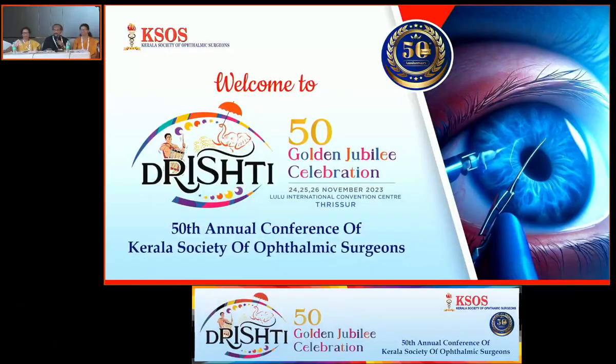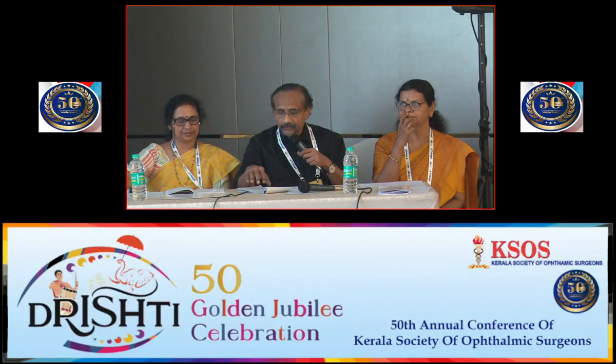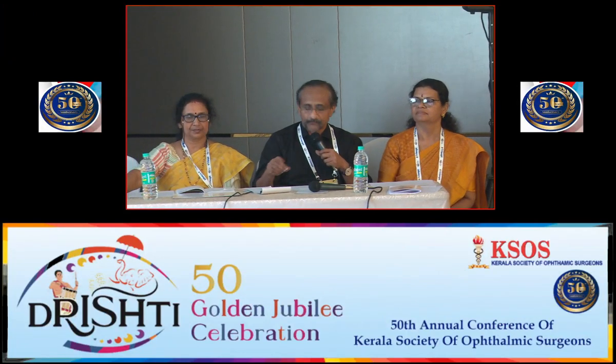Yeah, thank you so much, doctor. Yeah, very nice. Now we have Dr. Dahlia talking to us on soft contact lens fitting. Dr. Dahlia is a senior teaching faculty at LIP Medical College.